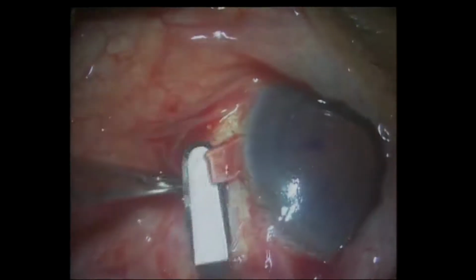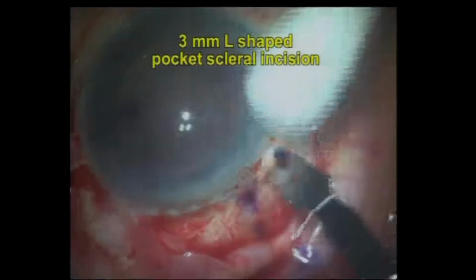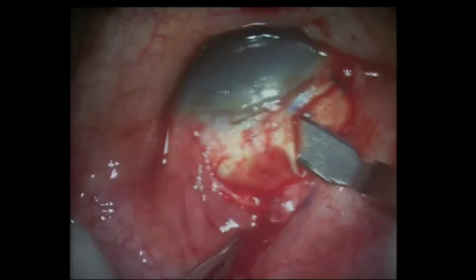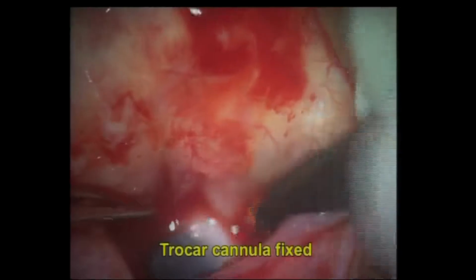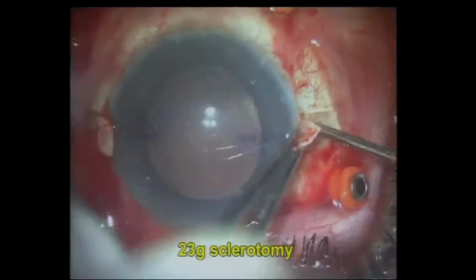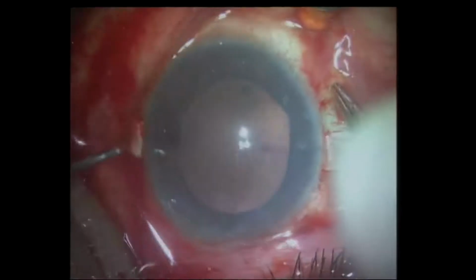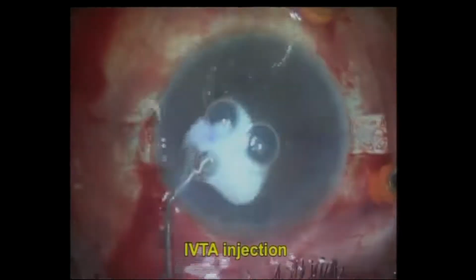So first up, I know I have to do a scleral flap, 180 degrees apart. So I'm using a 3 millimeter by 3 millimeter L-shaped incision. The L-shaped incision actually helps in reducing my astigmatism, making a smaller entry point, and removes the lens without any struggle. So I've made my flaps, made my sclerotomies and my side port entry.